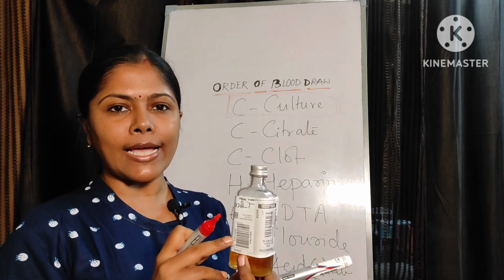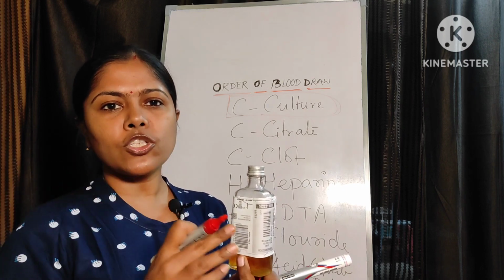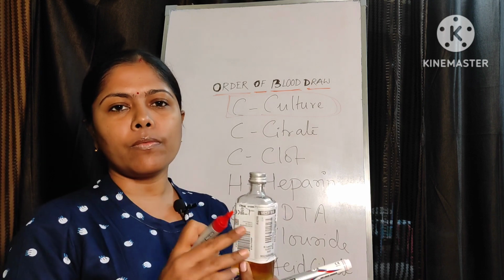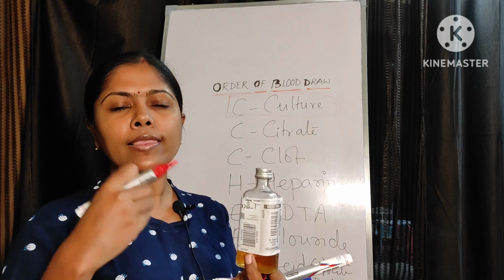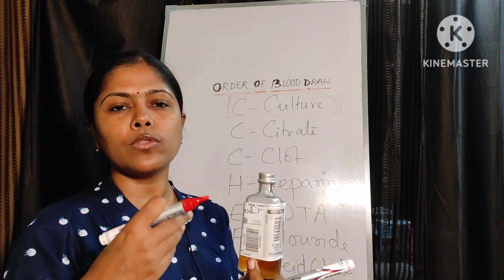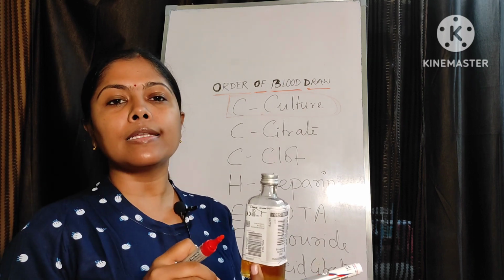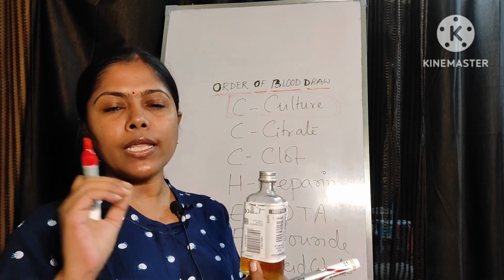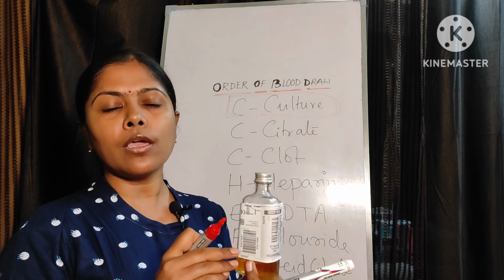This can be a normal flat bottle that has a capacity of 120 ml, or a BHI infusion bottle which has a capacity of 50 ml, and nowadays we use BacT/Alert bottles, where a semi-permeable membrane shows the color change due to change of pH from diffusion of carbon dioxide through the membrane. The amount of blood that should be collected in the blood culture bottle is 5 to 10 ml in adult patients and 1 to 5 ml in the pediatric population.